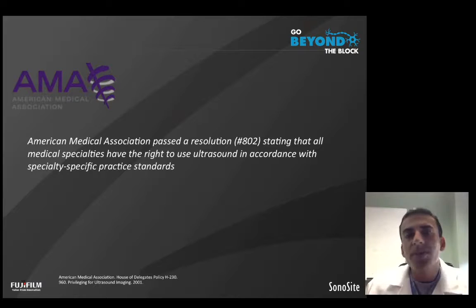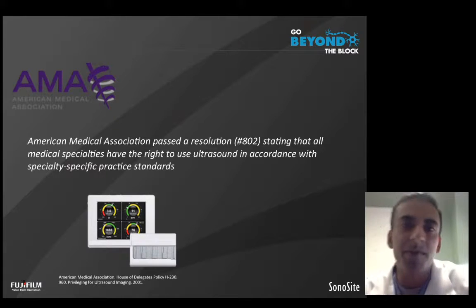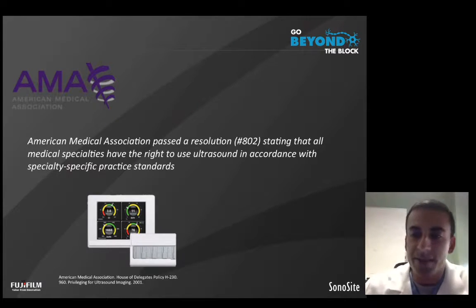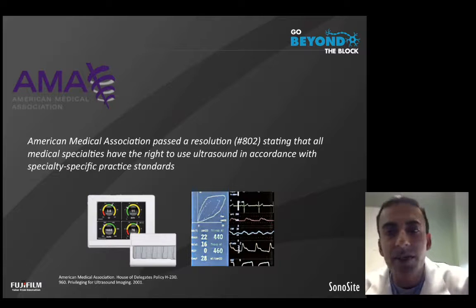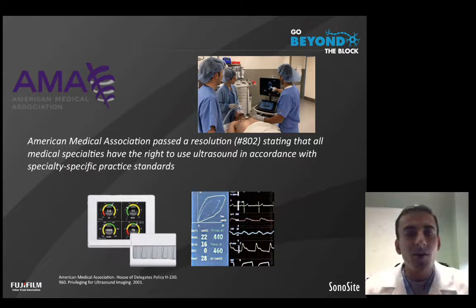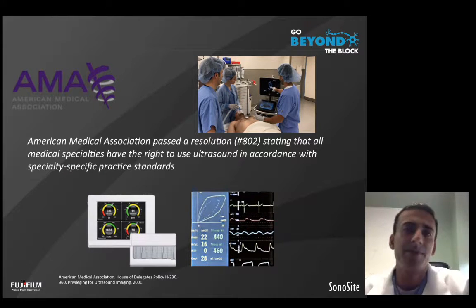But the approach to this concept of point-of-care ultrasound is similar to any other technology that's been implemented to improve perioperative management. For example, technologies that now look at the arterial waveform to provide flow dynamics of cardiac output and stroke volume, or advanced anesthesia machines that now provide real-time spirometry and flow volume loops. The idea of point-of-care ultrasound should again be incorporated in this same arena as a tool and technology that can help us improve our perioperative assessment and overall perhaps improve perioperative care.